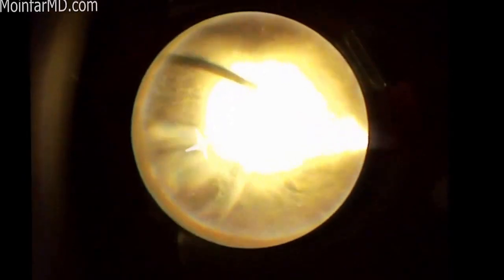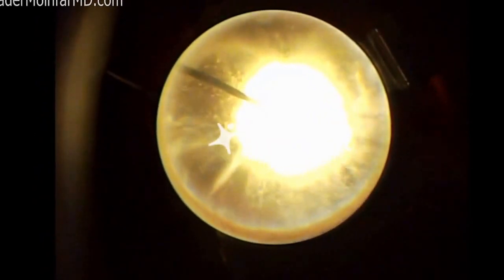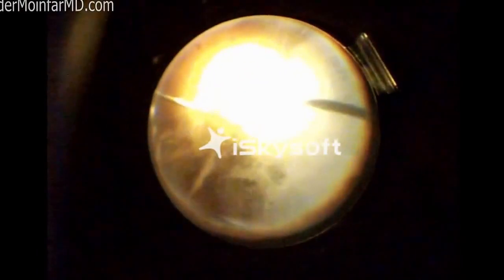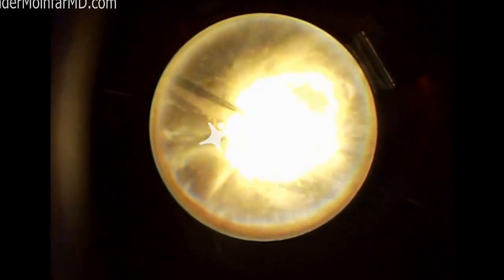This patient, as you may have noticed at the beginning, has her lens in place. In fact, like many diabetics, she already has a fairly significant cataract. Most of us with a fair amount of experience can work around the cataract, but it does present certain challenges during a vitrectomy. One of the risks in a patient with a lens is that the instruments going inside and outside of the eye can hit the lens and cause a traumatic cataract. So we have to be very careful in these cases to make sure of our spatial orientation, and that we don't move the instruments too far anterior and risk damaging the lens.